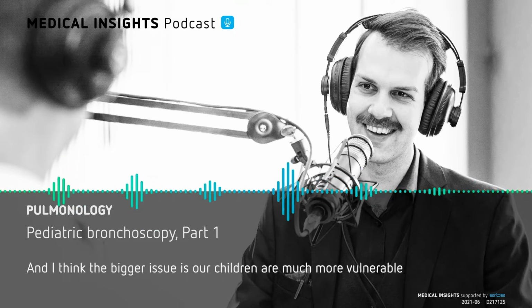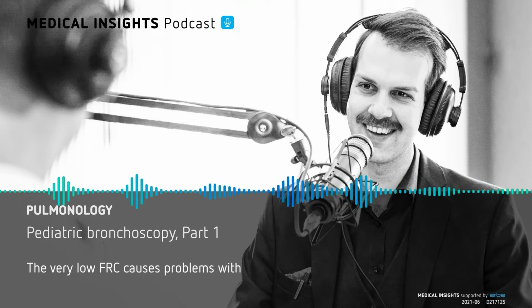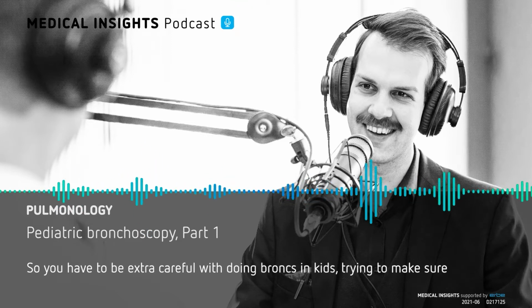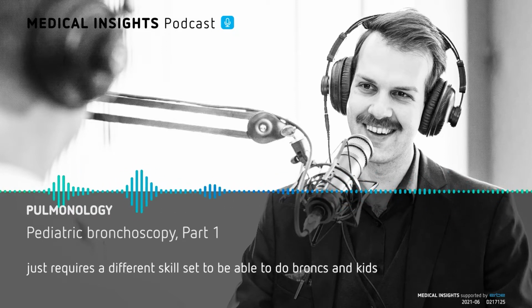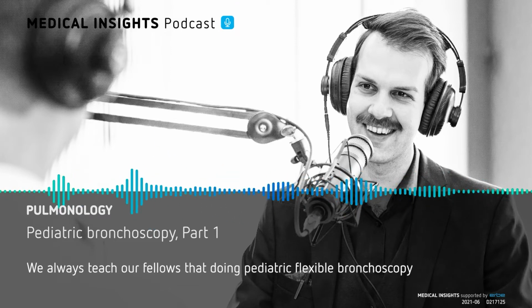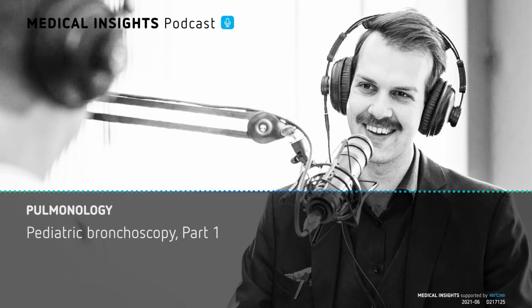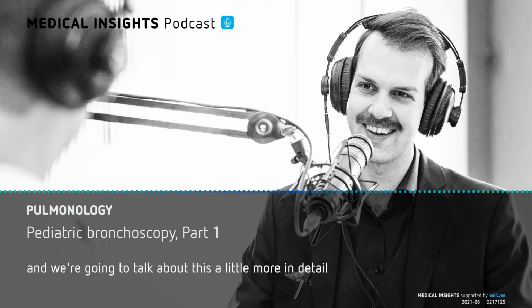And I think the bigger issue is our children are much more vulnerable when doing bronchoscopy. The very low FRC causes problems with really maintaining good oxygenation that just isn't seen commonly in adults. So you have to be extra careful with doing bronchs in kids, trying to make sure that you keep their oxygen levels good, their heart rate's good. It just requires a different skill set to be able to do bronchs in kids, and also a very different level of trust with our anesthesiology colleagues. We always teach our fellows that doing pediatric flexible bronchoscopy is probably the most difficult task that we can ask of a pediatric anesthesiologist.